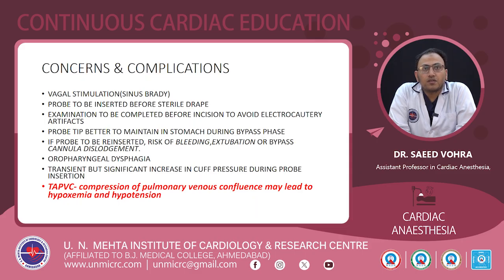The probe tip, it is better to maintain in stomach during the bypass phase to avoid the esophageal injury. If the probe is to be reinserted during ongoing surgery or by coming off bypass, the risk of bleeding or extubation or cannula dislodgement has to be weighed against the benefit of reinsertion of TE probe.